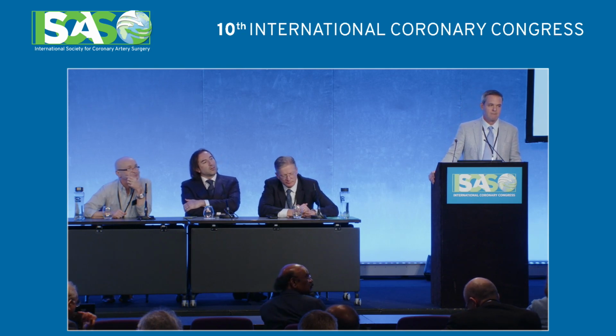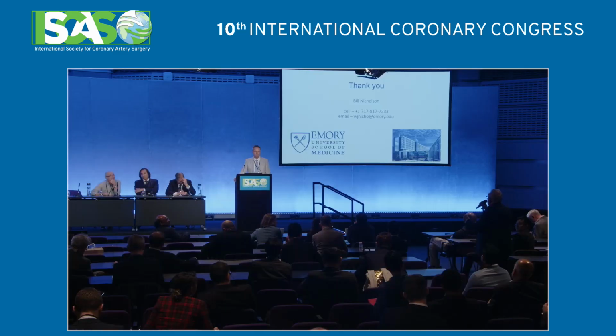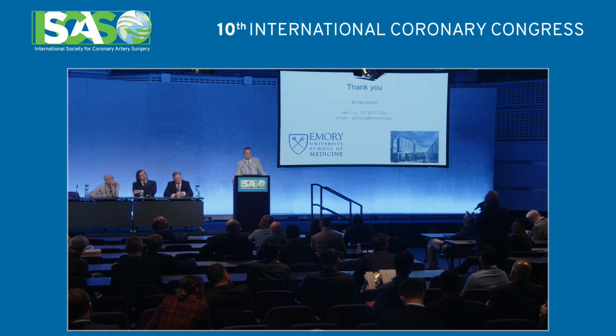Yeah, I'm impressed by the fact that in Europe, in the big trial on PCI that we are conducting, 32% have a CCTA before going to the cath lab. And I'm surprised by the fact that angiography is quite a poor tool to see the calcium. You suspect, but no more than that.